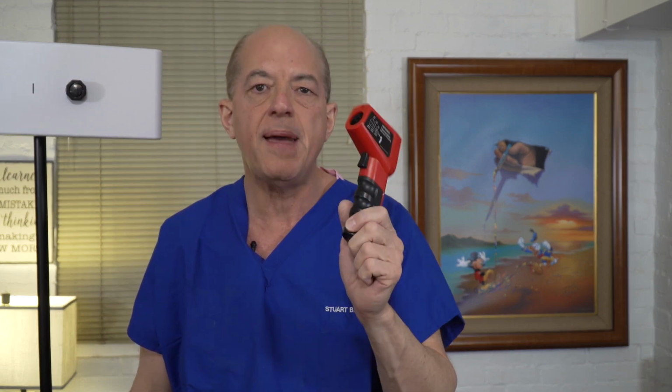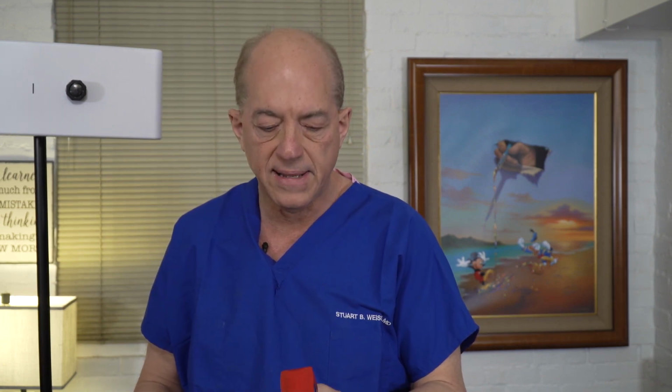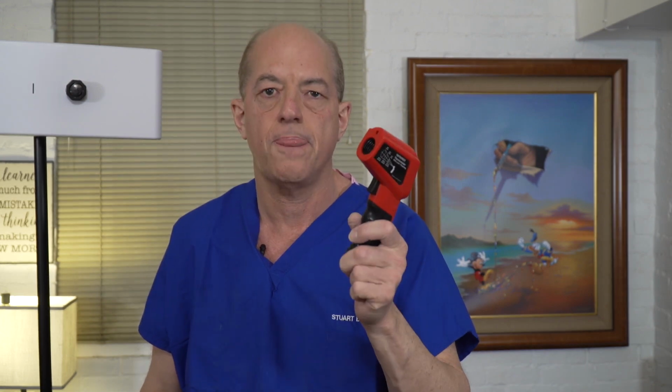You need to be careful on looking at the specs, because, for example, we looked at a whole bunch of these, and this particular one is plus or minus 5 degrees Celsius. So that makes this one pretty much not so useful for humans, because with a plus or minus 5 degrees Celsius, I could have a raging temperature and still show up normal. So, for example, my temperature right now was reading as 93 degrees.